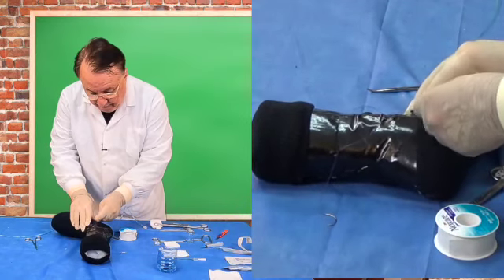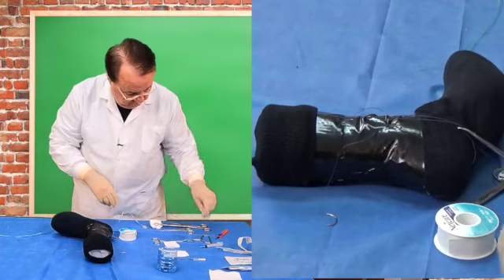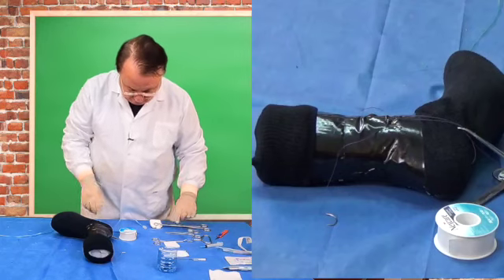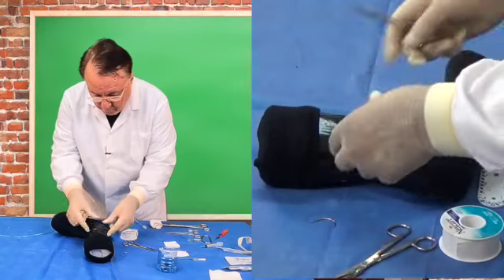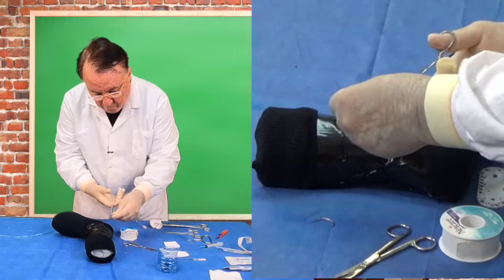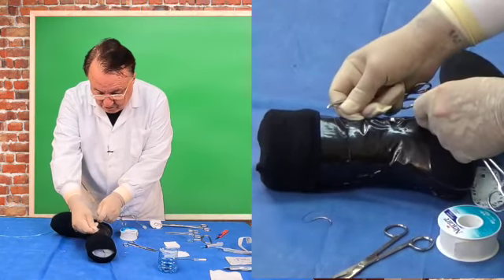And I put an artery forceps on one end and an artery forceps on the other end. And we now have control of the vessel.